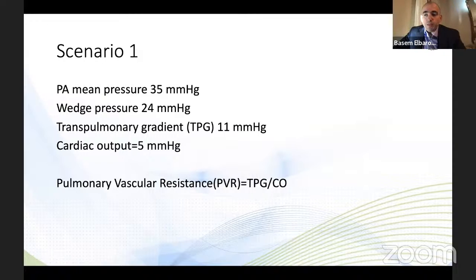If you have a left bundle branch block and there's a good indication for the right heart cath. If the indication is kind of soft, I'll probably cancel it. If there's a good indication you really need it, then the first thing is I would definitely not go femoral, because you don't want to play around. Femoral is a bit more challenging to get the catheter in. I'd go either IJ or subclavian or antecubital, because it'll float quicker.